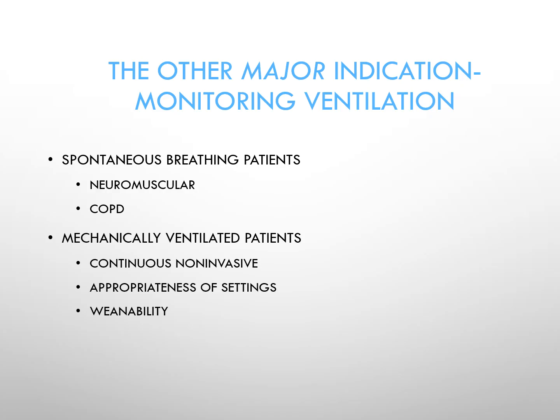For both intubated and non-intubated patients, it can speak to the appropriateness of the settings. If it's non-invasive, is the difference between the IPAP and the EPAP, the delta P, sufficient? If there's a backup rate, is the rate sufficient to keep the end-tidal CO2 within targeted levels?